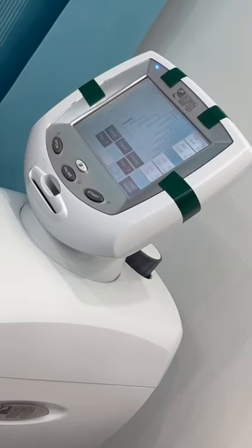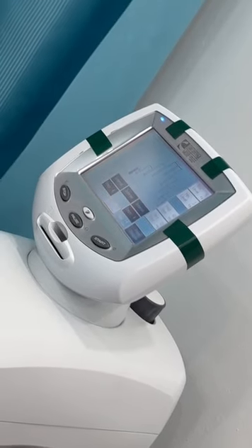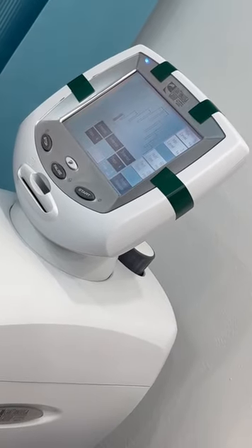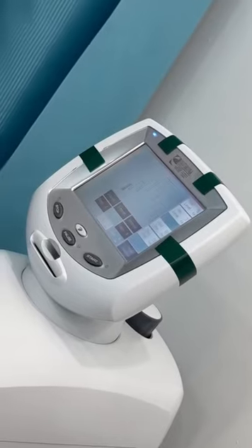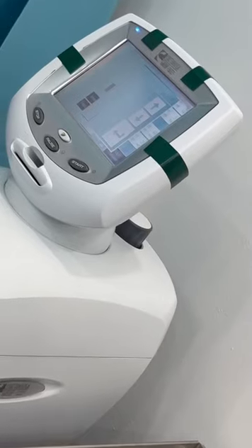Make sure that the maximum traction force you are keeping should not be exceeded. Unknowingly you should not select the lumbar traction force for cervical traction. You should be very careful in that area. This minimum we can keep at 0, not a problem.